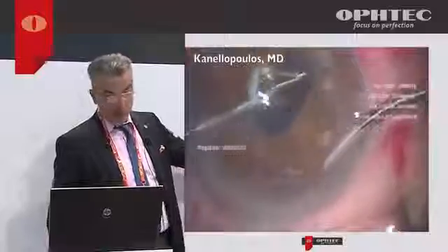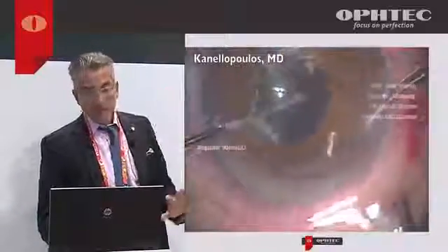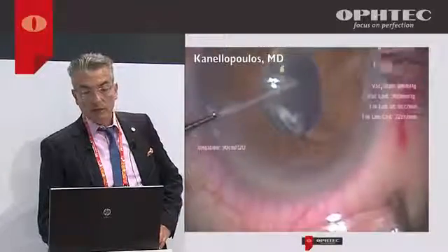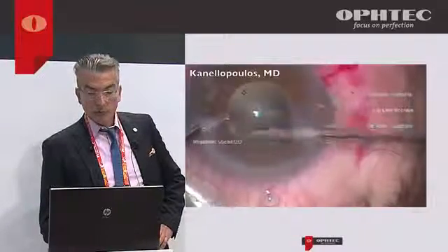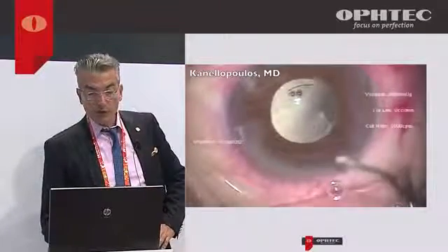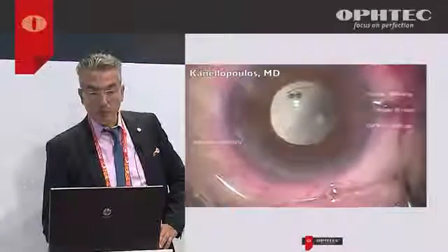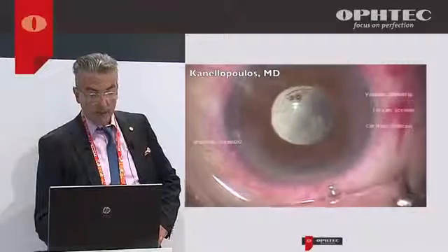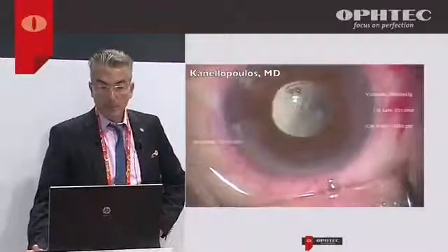Due to the posterior chamber lens sunset and instability and the poor capsular support, I'm going to take this lens out, and I'm going to use again triamcinolone to stain the vitreous that's probably present, perform a thorough vitrectomy, and now we'll go on to the Artisan implantation part.